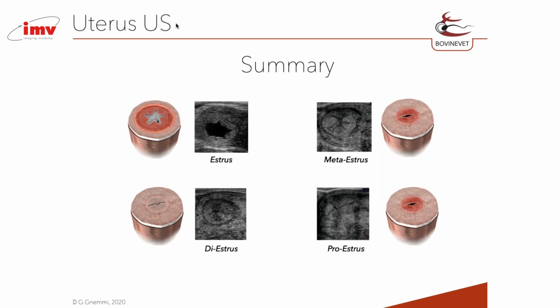During the estrus, and every time that we have a higher level of estrogens, so during the follicular phase, proestrus and estrus, estrogen improves the contraction of the myometrium and improves the echodensity, so it becomes more reflective of the ultrasound waves and appears echogenic, white on the screen, while vascular tonicity improves, so the blood supply to the uterus improves a lot, the endometrium becomes thicker, and the shape of the lumen becomes like a star image or Christmas tree, and a lot of artifact called specular reflection appears.